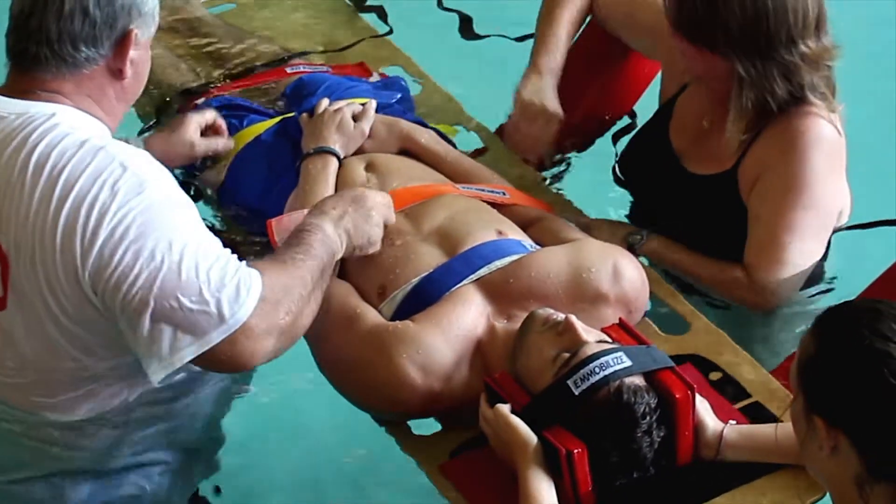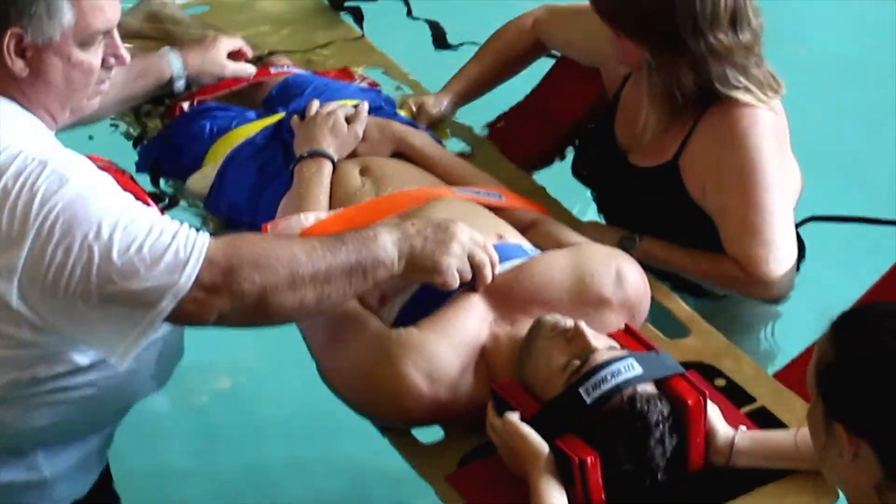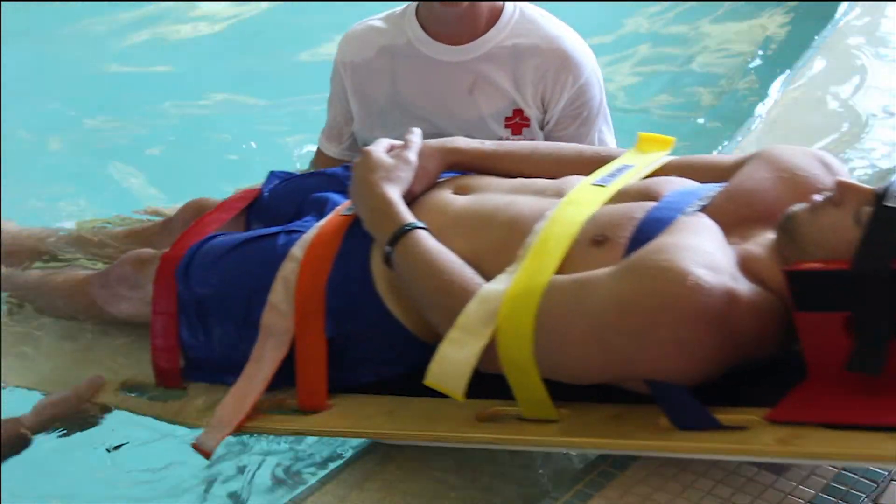The high-quality color-coded EMMOBILIZE Velcro body strap system ensures secure strap placement.